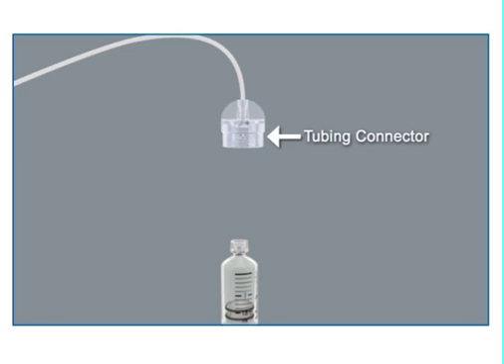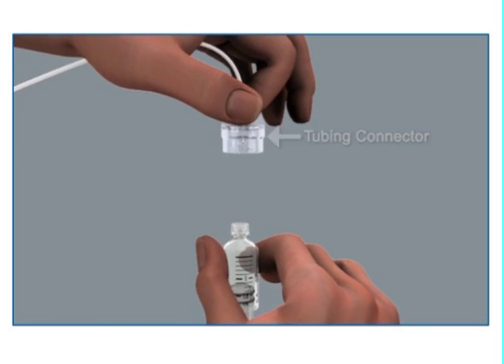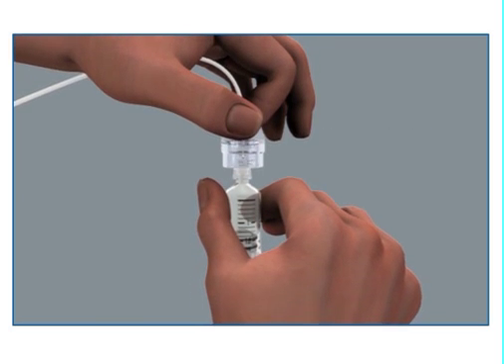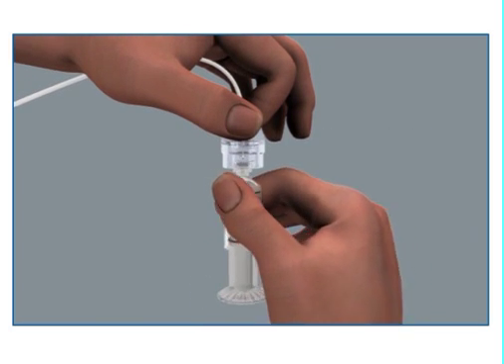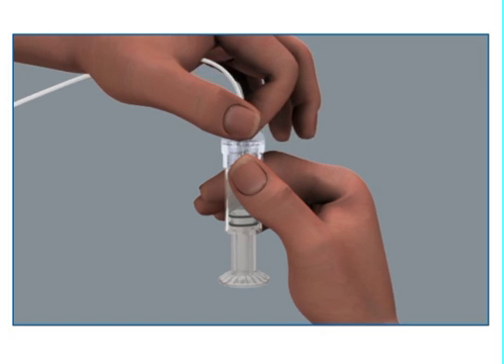To connect the infusion set to the reservoir, hold the tubing by the connector and place it on top of the reservoir. Find the right position by turning and gently pushing the connector until you feel it slide smoothly in place. Turn the tubing connector clockwise until the reservoir and the connector lock with a click.